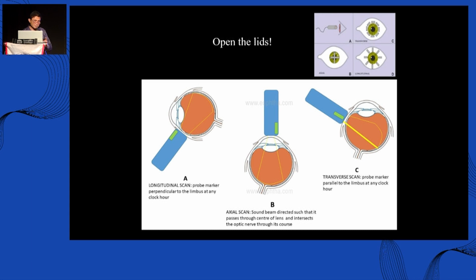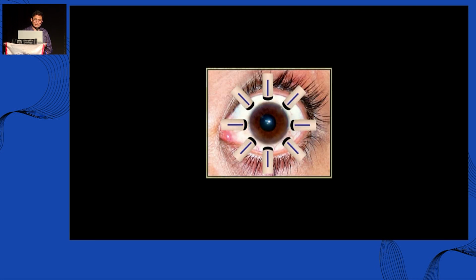And you put some drops, put gel for conductance, and then put the probe. And the probe, there's a marking either on the wire end or on the top end, which can become erased after some time, so be careful. Sometimes you can't see the probe direction. Then, on the open globe, you keep the probe in a specific manner. So you can keep it like this.